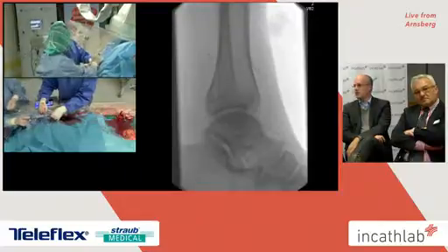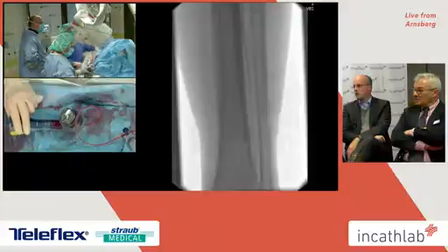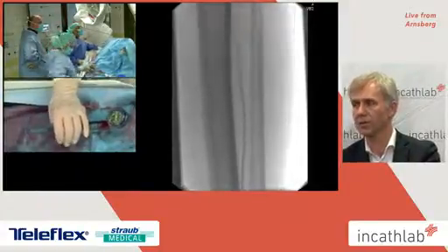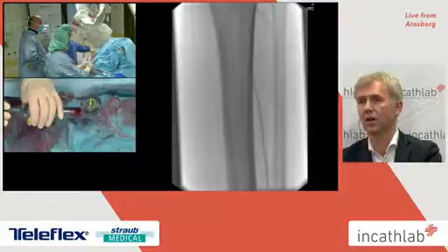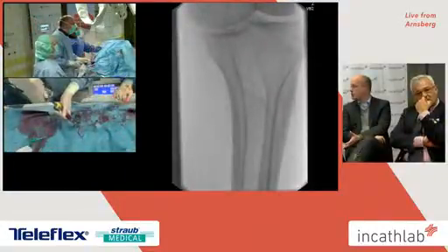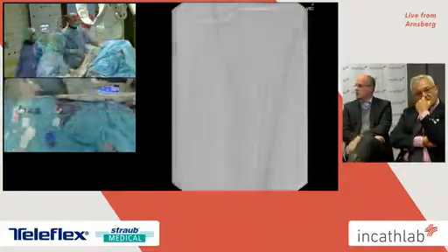Still a 4F system, which limits the balloon size to 1.5 to 7. So a very small one, but even large ones. You can use it also for an iliac, or also very well for SFA. So this is also very interesting for long SFA occlusions, where you have to find a way downstream.